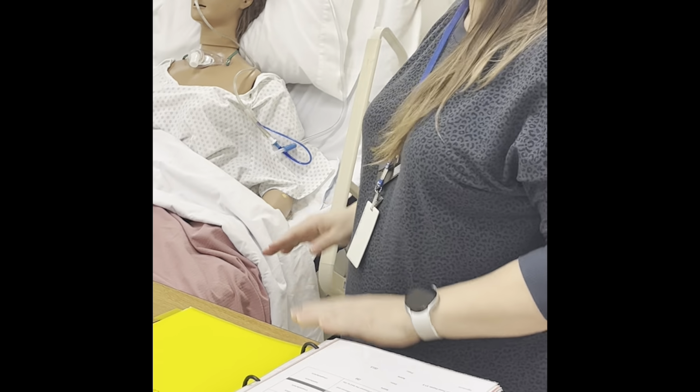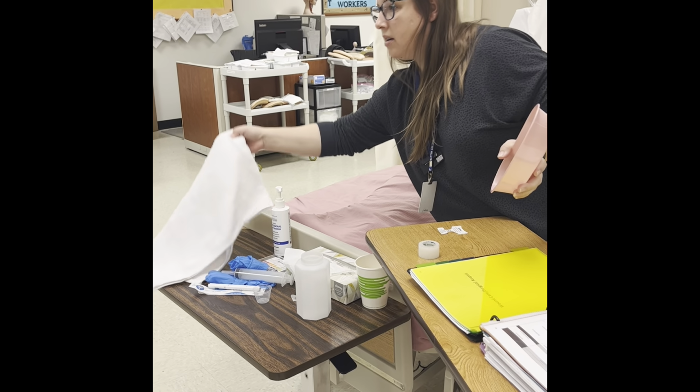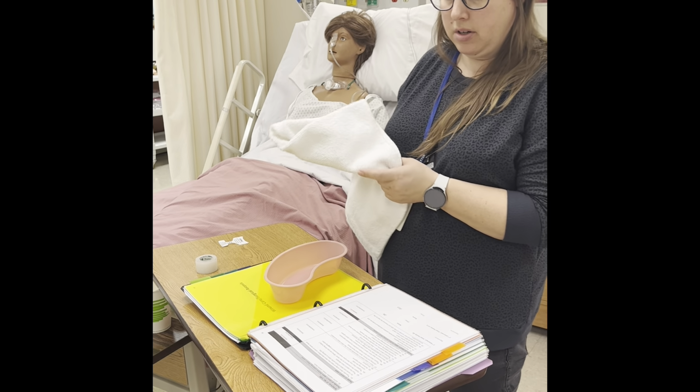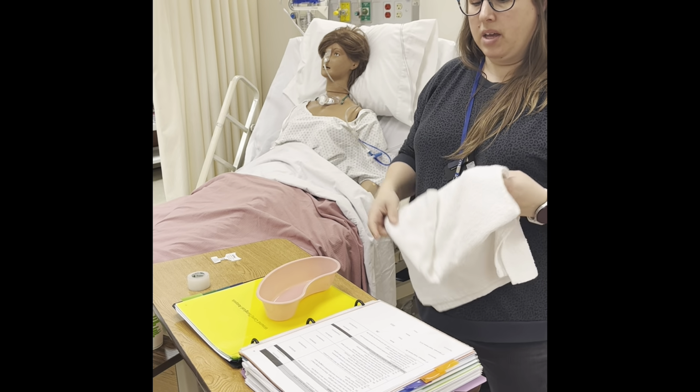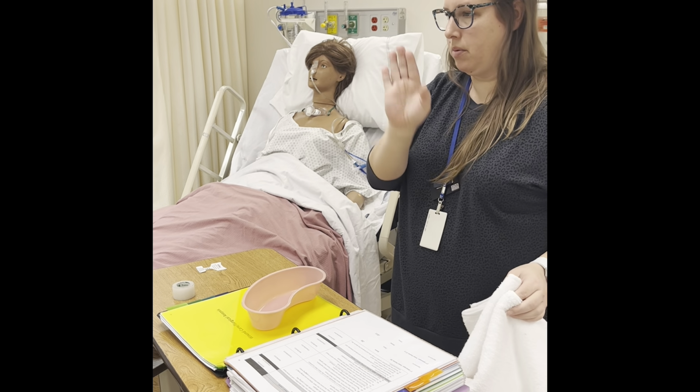All right, then it tells you to gather your supplies. Our supplies for this are just the emesis basin and the towel. So again, we want to make sure that we have the right patient, what their allergies are. The big thing, if you forget to identify them, it's okay because we've already done it once.